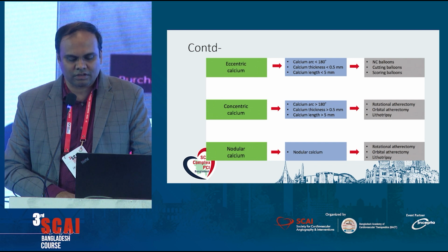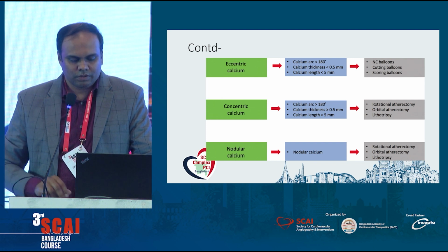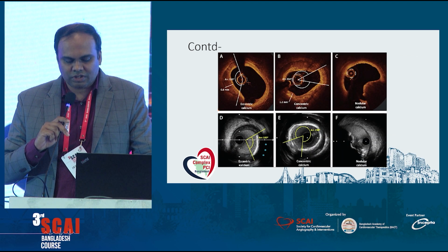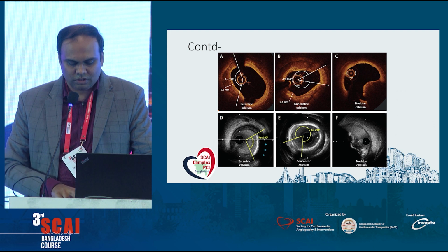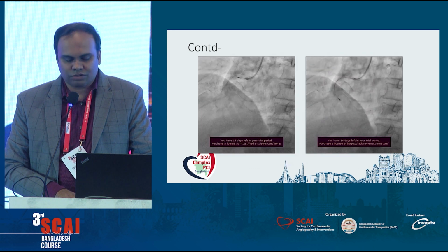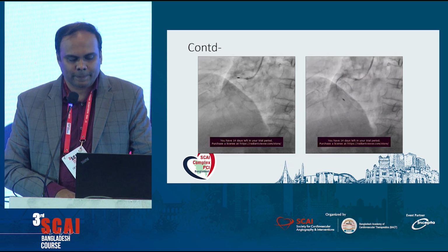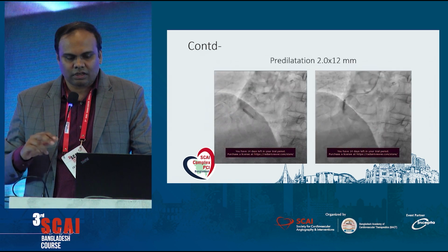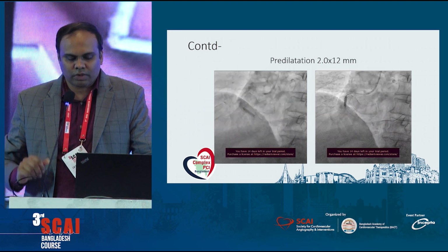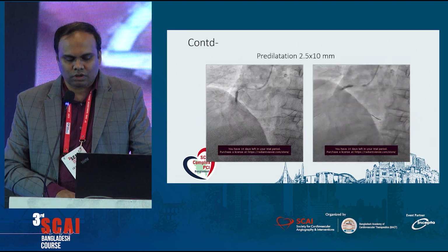This is the final result, and it is good. This is the post-stenting OCT run, which shows there is no edge dissection, and MSA was optimal, more than 80% of expected, and there is no under-expansion or malapposition of the stent, with good apposition. The 3D OCT view also shows there are no red or yellow marks for under-expansion of the stent.